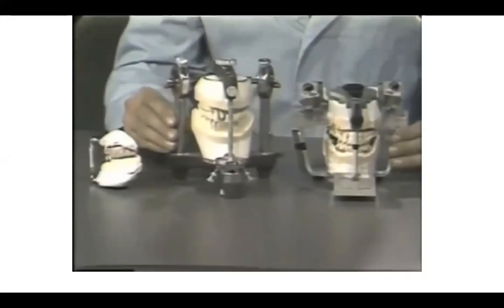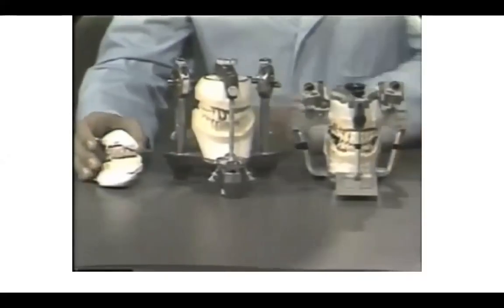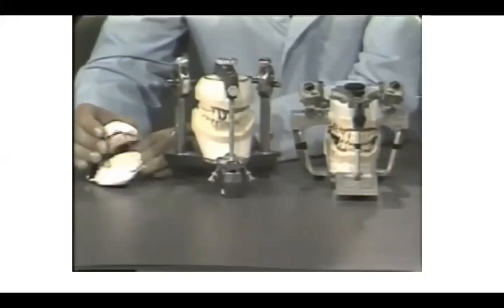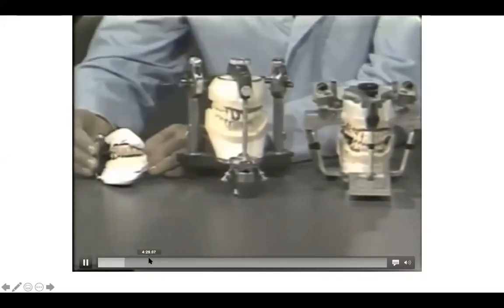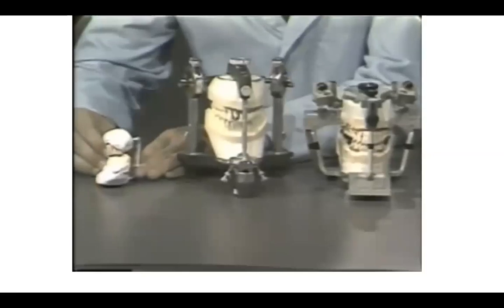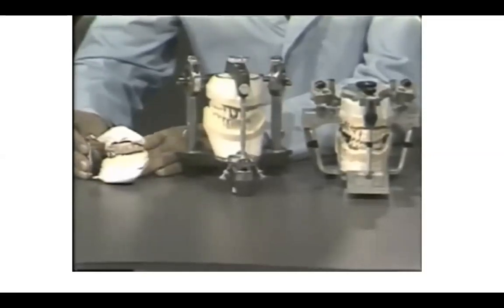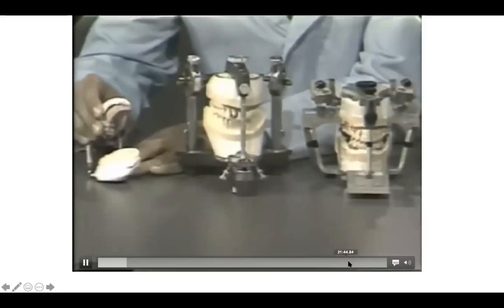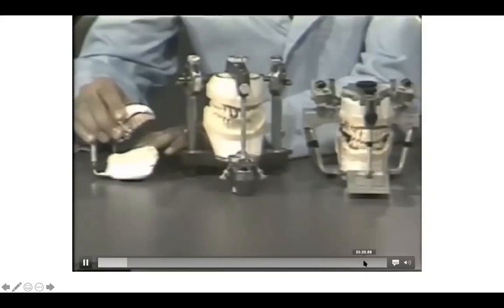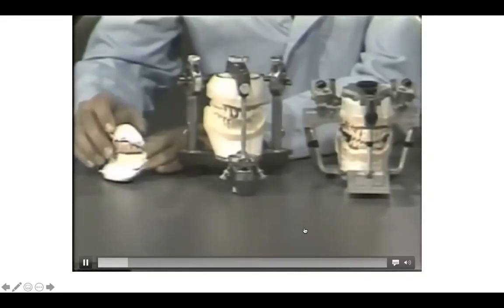The differences being, besides cost, the fact that this very simple hinge-like articulator is not capable of reproducing the movements of the mandible to any degree of accuracy. There are only slight movements about the hinges in the posterior, little springs rather.